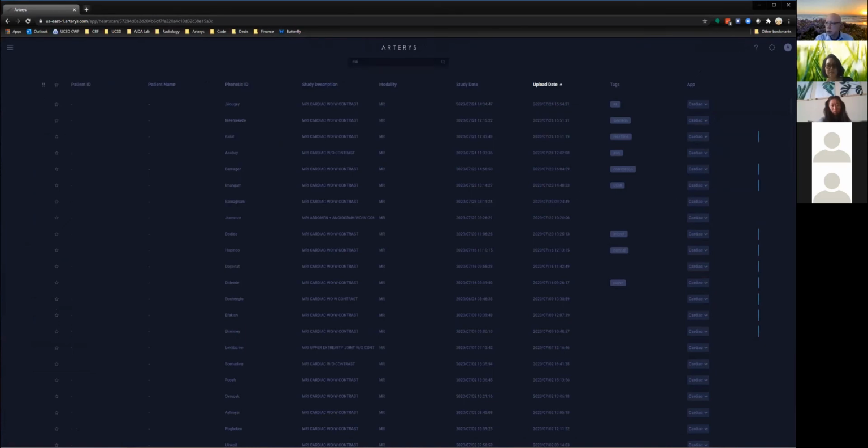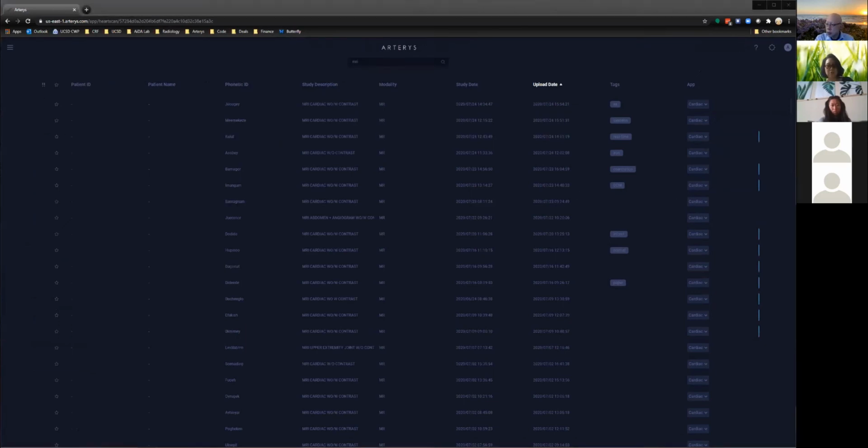This is a very basic question, but when you were drawing the circle to measure the velocity for the flow, the circle was a little bit more generous than regular phase contrast. Is that right? What would you recommend? You mean how to draw the segmentations?